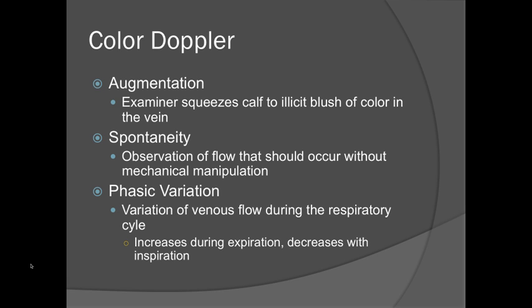The third thing that we talk about is phasic variation, which is just the variation of venous flow during your respiratory cycle. And it's kind of counterintuitive, but the flow increases during expiration and decreases during inspiration.